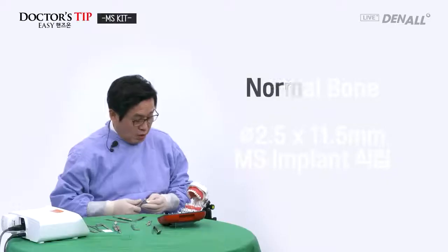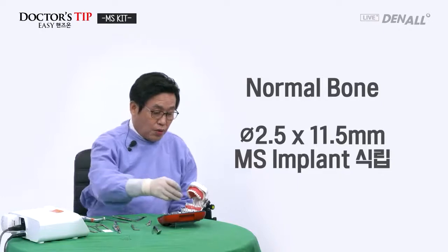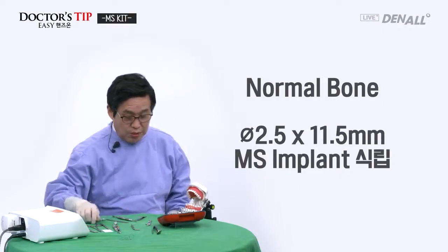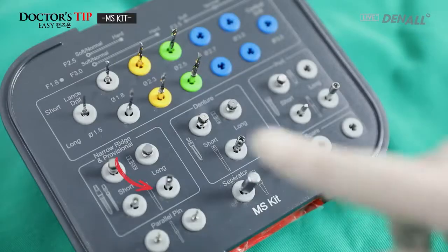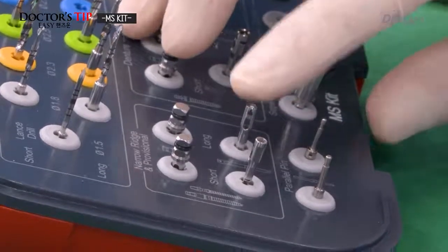And then, in the lower anterior side, let's assume it's normal bone. So the 2.5, 11.5 MS implant will be placed. I will use the no mount driver, the long type.